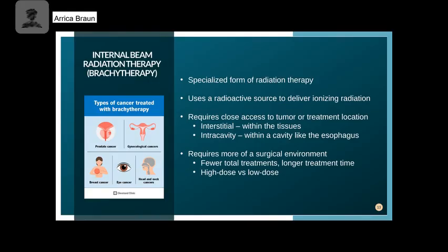Internal beam radiation therapy, also known as brachytherapy, is a very specialized form of rad therapy because we are using ionization from radioactive sources to deliver that total dose. So this is going to require us to be in close proximity to the tumor or the treatment bed, wherever we're at. So interstitial means that we are delivering that radioactive source within the tissues. So we're actually putting a needle through a tissue and inserting that radioactive material.